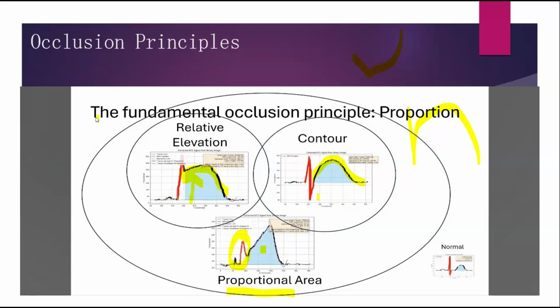She has a palpable P2, wide split S2, and a systolic murmur in the second ICS. So this ECG was done. What do you think of this ECG? What rhythm do you have? Kindly vote. So there are two answers.